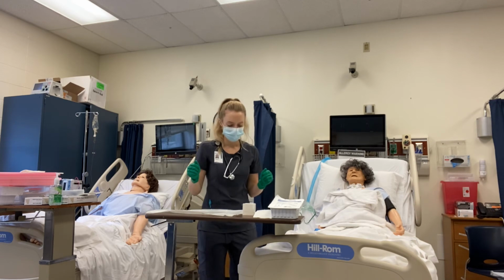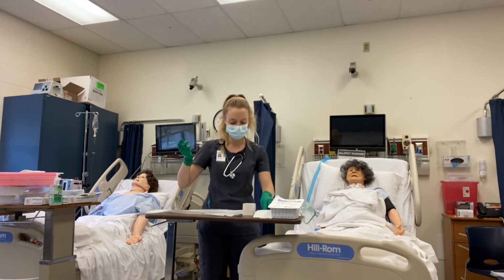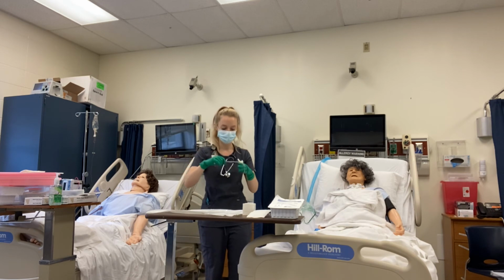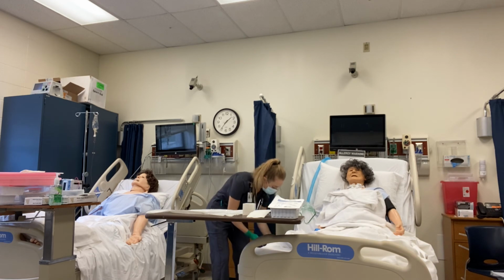Okay, my next step is to take my suction catheter. My dominant hand, I'm going to keep clean through this procedure, and I'm going to wind this around. My non-dominant hand, I'm going to go ahead and get dirty by connecting this to the suction.